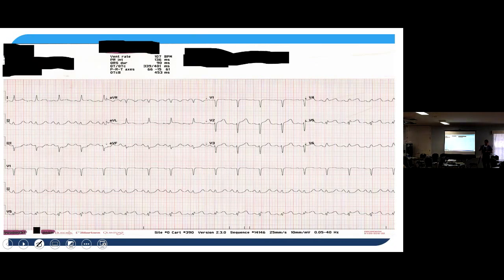There's no risk to a 12 lead. If one 12 lead says STEMI, there's no reason to do another one. You're done, right? You got all the data you need. You bring me a STEMI 12 lead, they're going to go to the cath lab no matter if it changes on me. If they don't have a STEMI, keep hitting it.